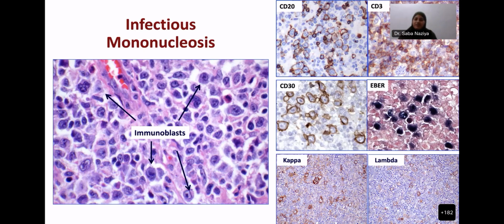Okay, what do you think about the range of cell sizes? So can you be absolutely sure this is not classic Hodgkin? It would be a bad miss. CD45. Yeah, CD45 can be helpful, but it's extremely difficult to read, right? Often because every cell is positive. So if you want to truly interpret, you need to go to cells that are back to back and make sure that the intervening membrane is positive or not. So it can be helpful.